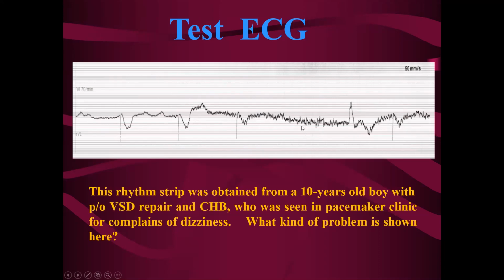So what we have here is this patient is oversensing. Therefore, there's no pacing delivered. And it's quite a long oversensing. And because there's no pacing delivered, finally the patient came out with their own ventricular beat. And then it paces again. So this is an example of oversensing, ventricular oversensing, inhibiting the pacing.